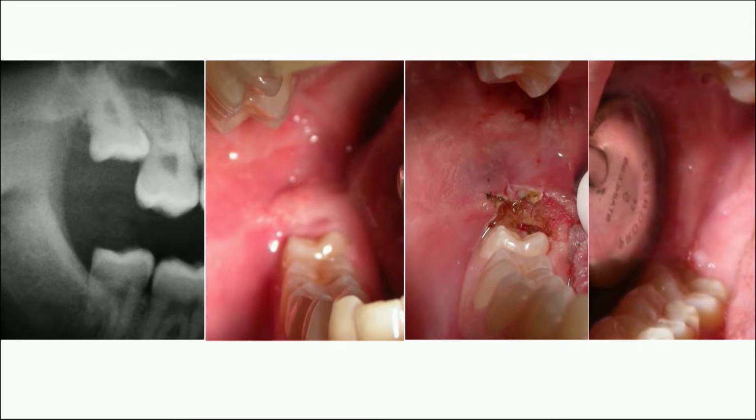And the case you're looking at here was treated by a couple of my final year students. It was an operculum case, and what we've got here is the removal of some of the tissue around the molar tooth, but it's actually taken these students, because they're novices, a lot longer, and as a result they've got a little bit more collateral injury. That's why the tissue looks a little bit white and a bit dry. That would be a sign that someone's been puddling around there a little bit longer than they might have otherwise done. It doesn't look quite so well done, which is what you saw on the earlier images. So you should get in and get out.